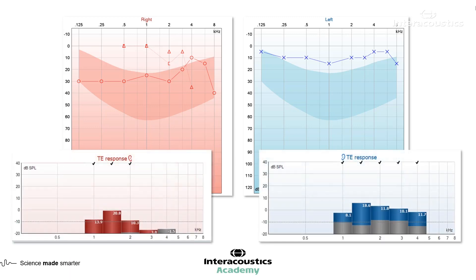We also have his OAEs. The TE OAEs were performed here. Now, the left-hand side is a very clear pass. On the right-hand side, we've got three bands that have passed if we're using a minus 10 response floor. That would probably pass most criteria around the world.